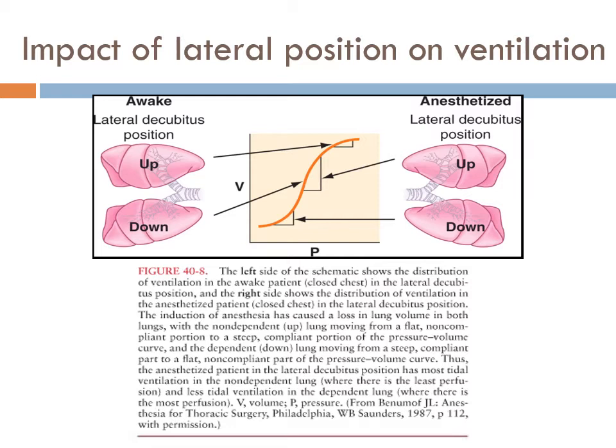You can shoot pressure at someone all day. You can blow into a balloon, but you know at a certain point where you put enough pressure, like with those party balloons, the balloon finally inflates, right? And then it turns into a big balloon, and that's basically the tidal volumes you're looking for, vital capacity breaths, whatever it is. So there's a sweet spot between here and here.